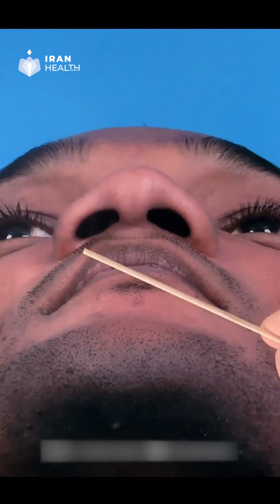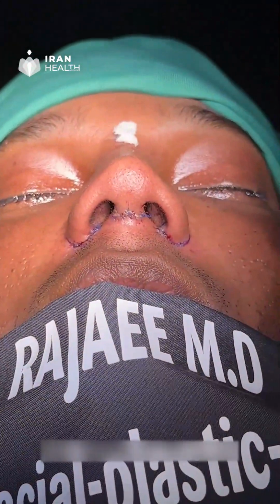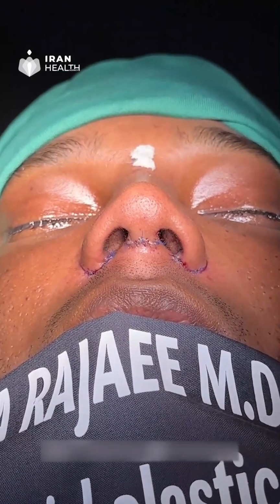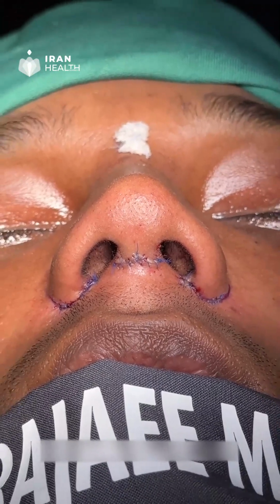We have had 2 cuts here, bringing back the ala much closer to midline to rebuild more curved alar side walls.